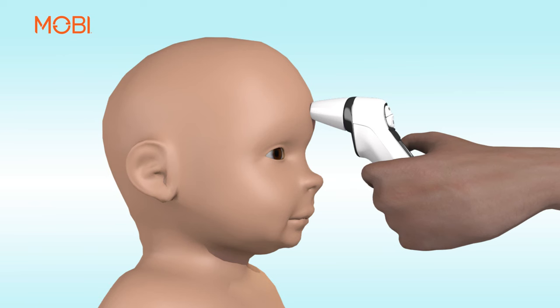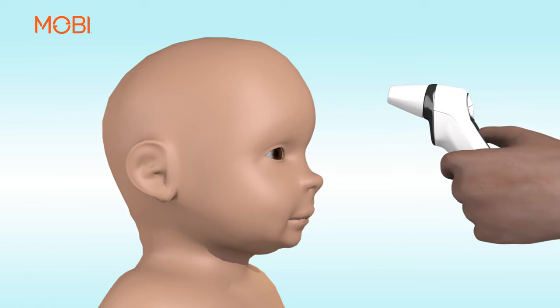With no excessive hair, then press and release the head button. You will hear a short beep. The temperature reading has been completed.